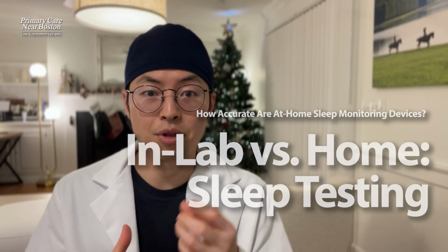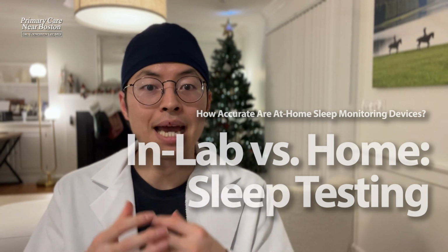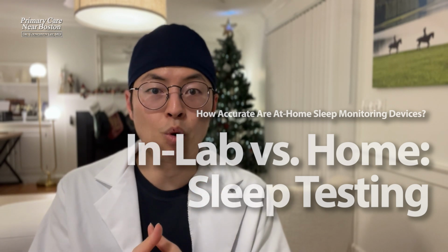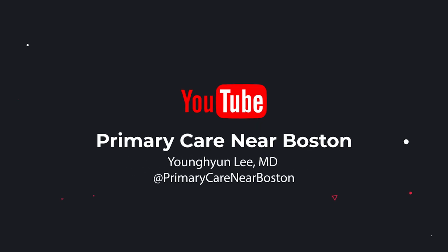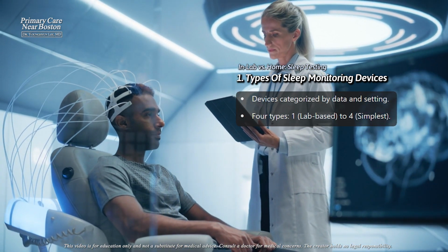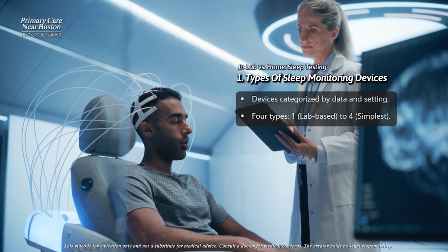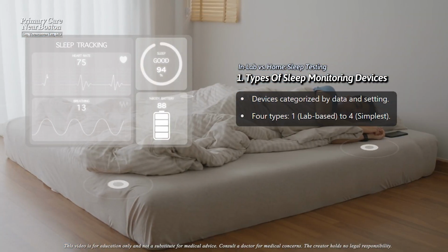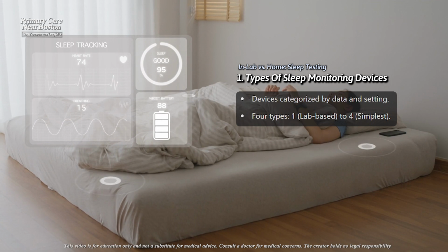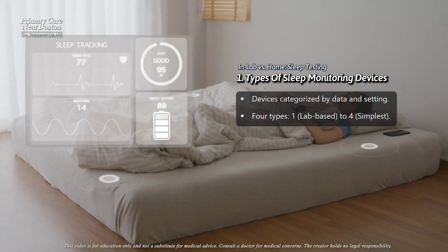We will discuss the types of sleep monitoring devices, which are categorized by how much data they collect and whether they are used in lab or at home. There are four main types. Type 1, lab-based PSG with technician, is an in-lab setup with full monitoring capabilities, while Types 2, home PSG-like device, 3, common home device, and 4, simplest home device, are portable devices commonly used at home.